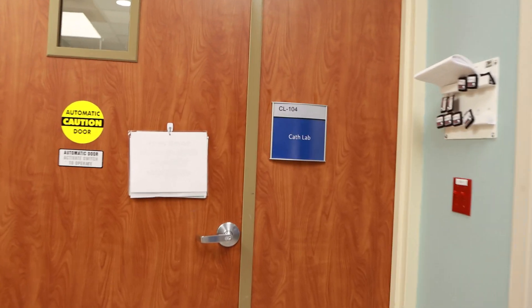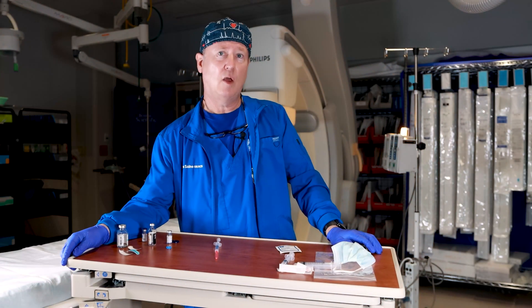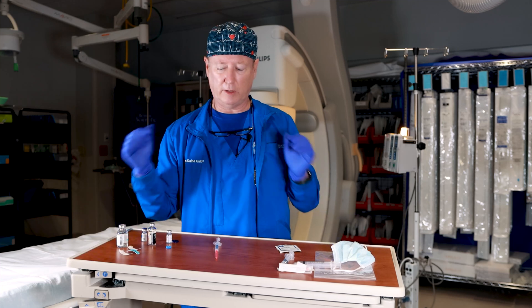Hey guys, James Cain here. So let's talk about when you have to give medications, which syringe to use, and how to draw the medications.